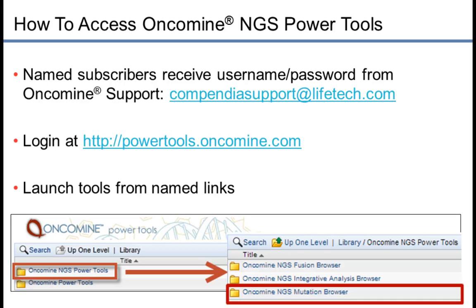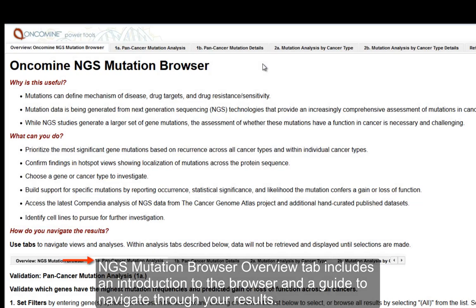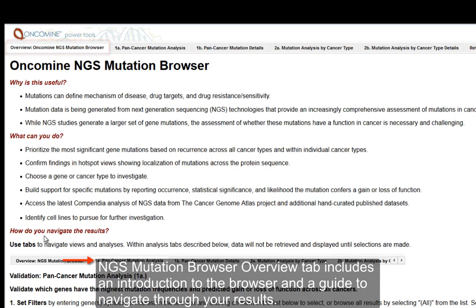Under NGS Power Tools, select Oncomine NGS Mutation Browser. If you have any questions after watching this video, please contact us at compendiasupport at lifetech.com. Once you've logged into the NGS Mutation Browser, you'll come to this overview screen, which is the first tab and has an introduction to the browser, as well as a guide to help you navigate through to the different tabs.